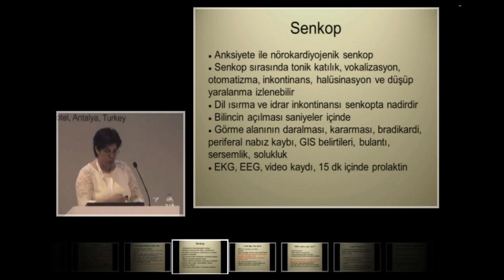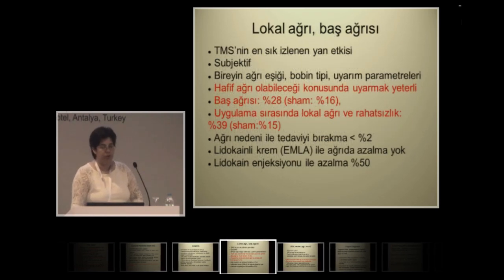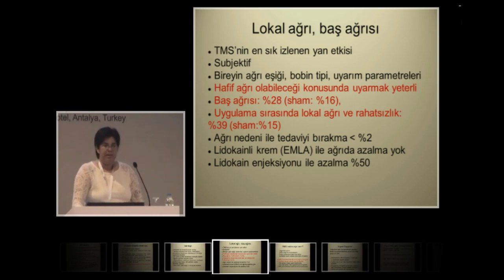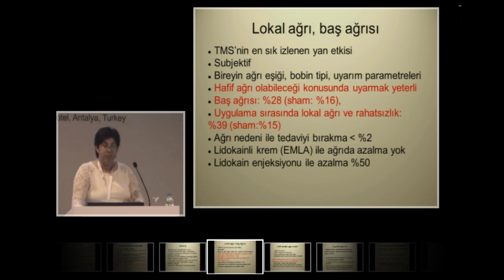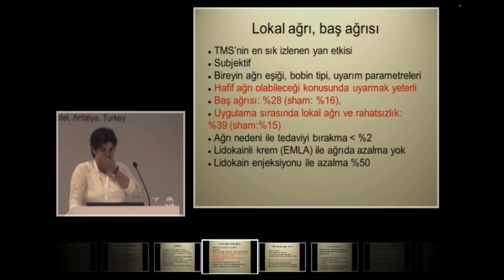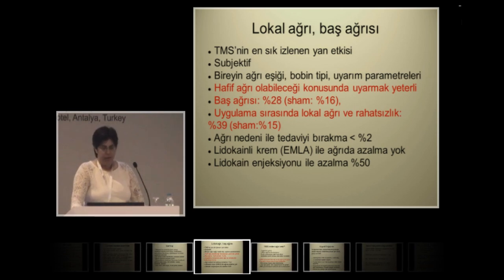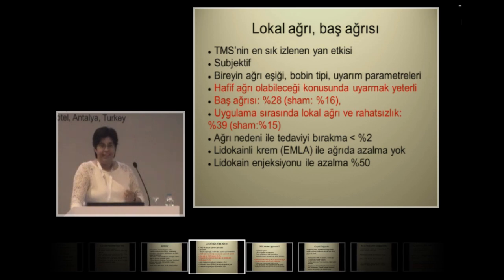So it's really not hard to tell just by looking at the patient between syncope and seizures. Local headache is very subjective depending on the pain and threshold. The type of coil and the stimulation parameters may be important factors. To be frank, it's not a serious pain, but it's a subjective symptom that is described by the patient. It's reported in 28% of the patients included in the studies. However, if sham is used, again, there is 16% headaches.